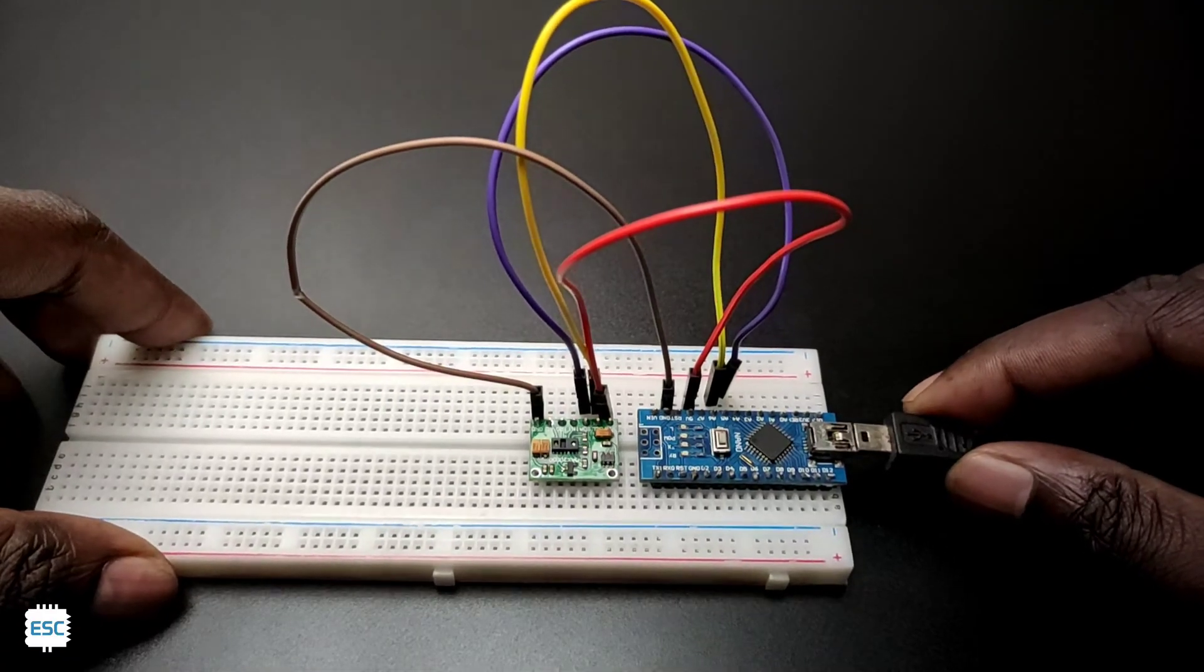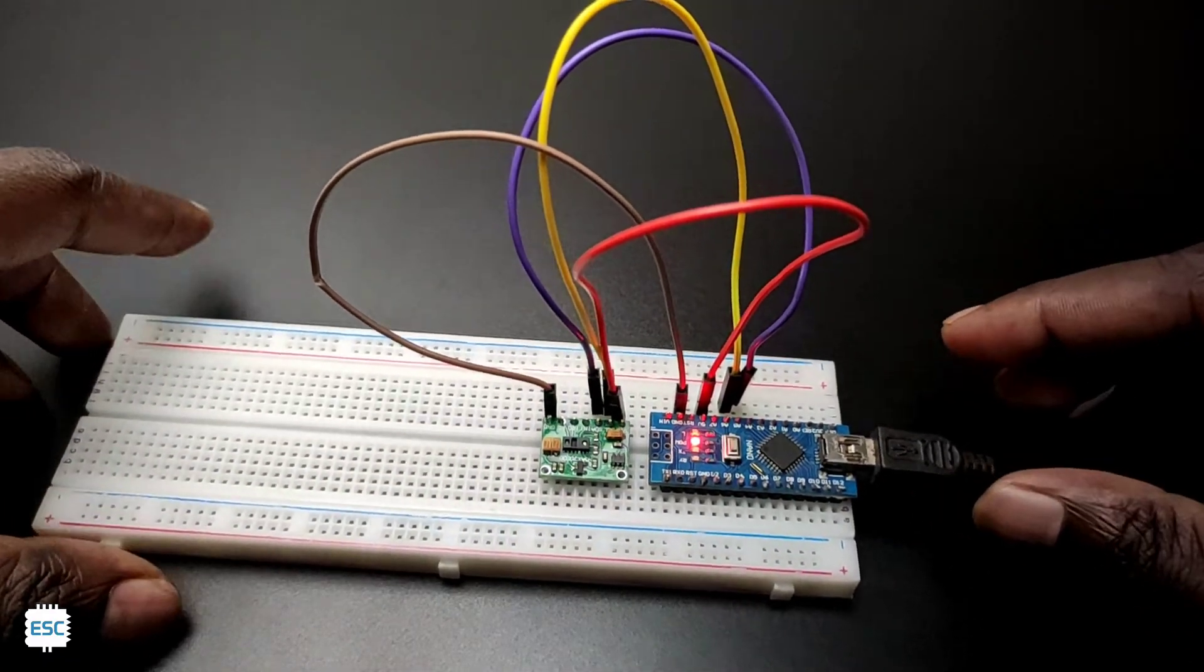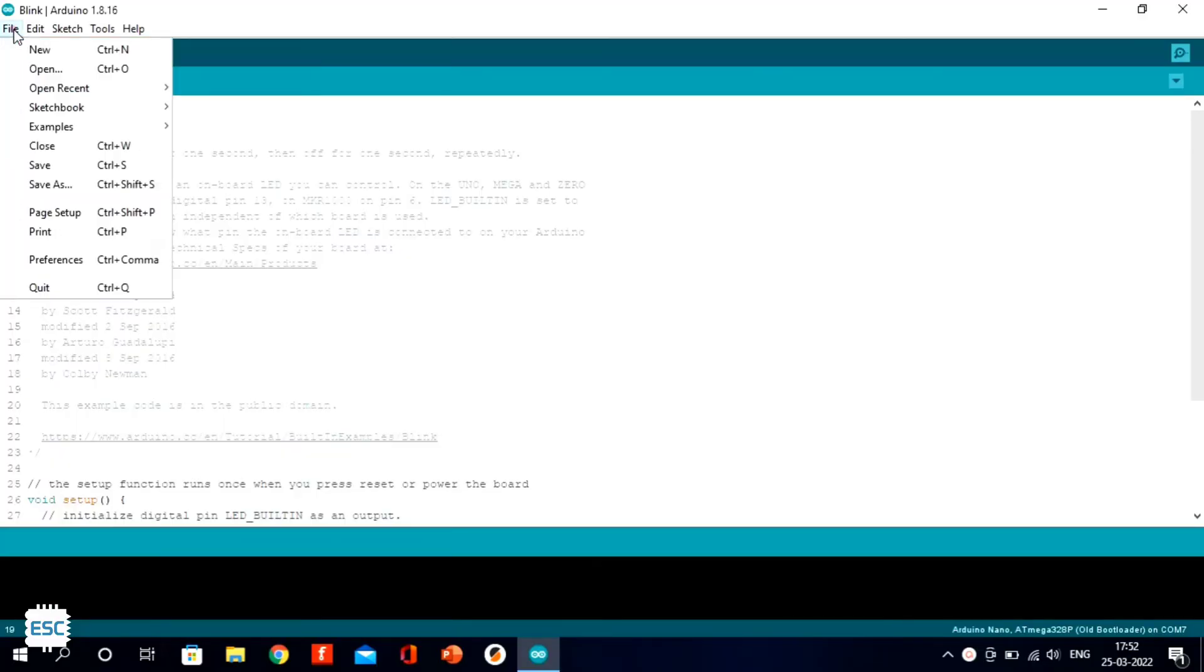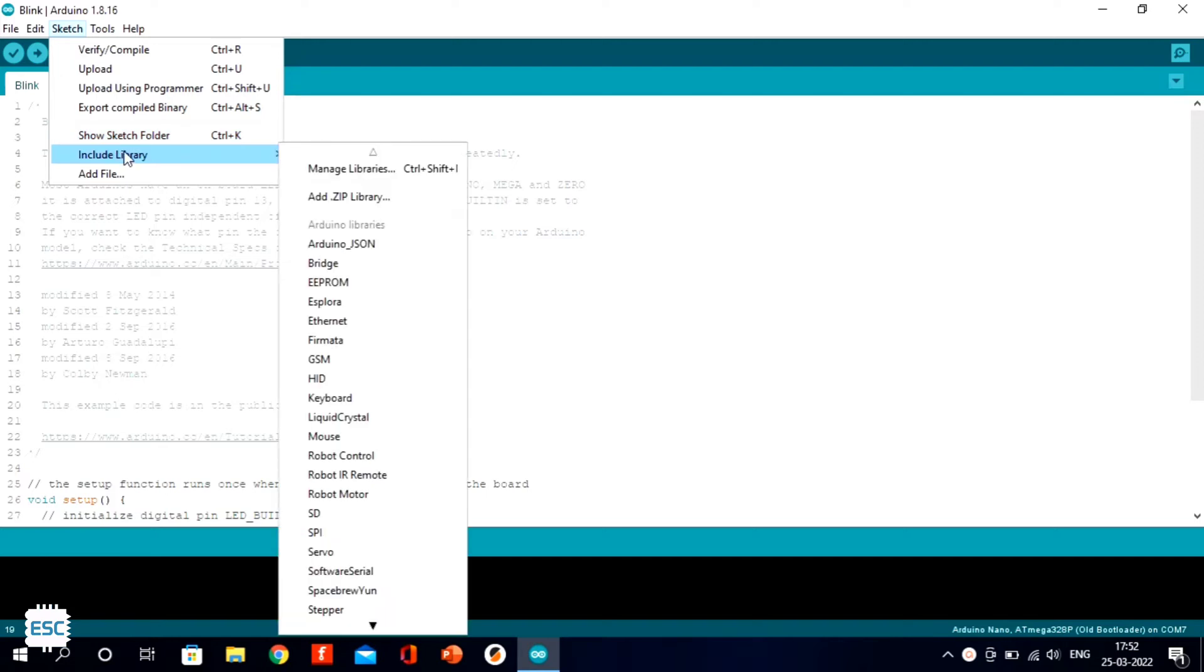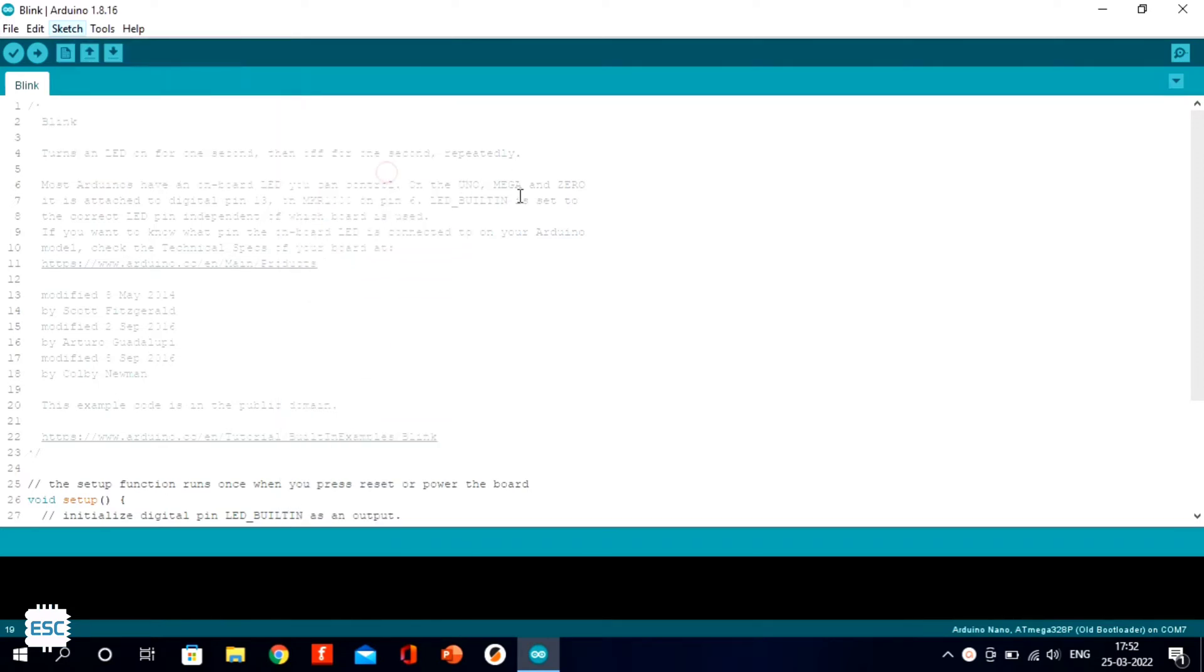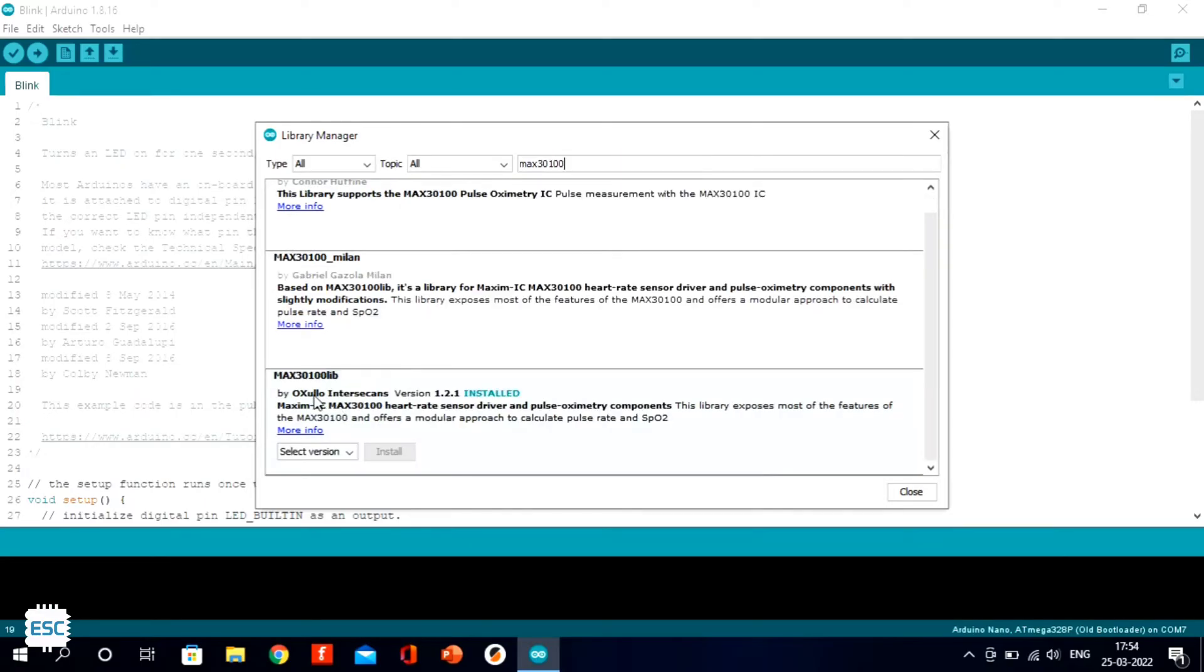Now I connected Arduino to the computer and opened the Arduino IDE. We need to include the oximeter library, so I went to Sketch, then Include Library, then Manage Library, and searched for MAX30100 and installed the library.